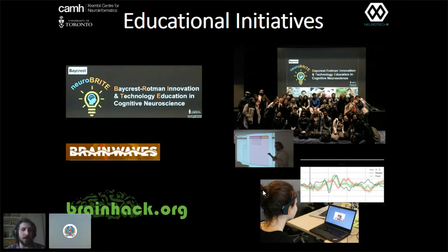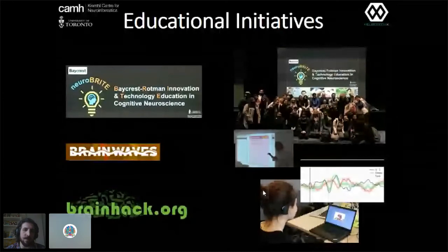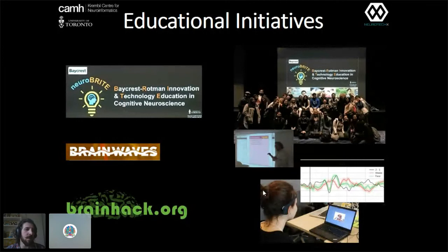So this was something that I was speaking to earlier, is there's a lot of scope for using these tools that are really doing, quote, real science, right? The visual face house responses, that's something that card carrying perceptual psychophysics cognitive neuroscientists do. But you can definitely do that in a high school. You could do that in an undergraduate science class. You could run the experiments at least very easily with large numbers of people with the hardware that I've been talking about, and with some of the software that we've been developing. And that's one of our target areas amongst others.